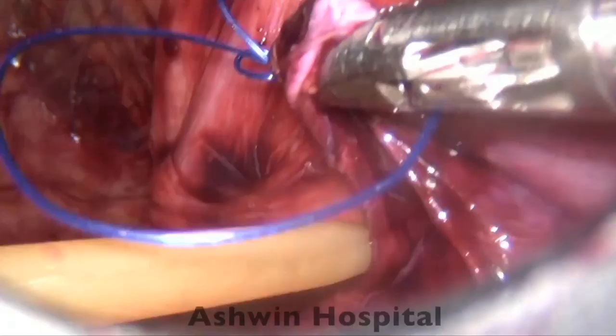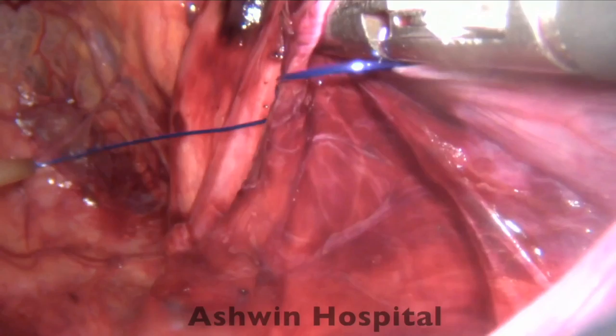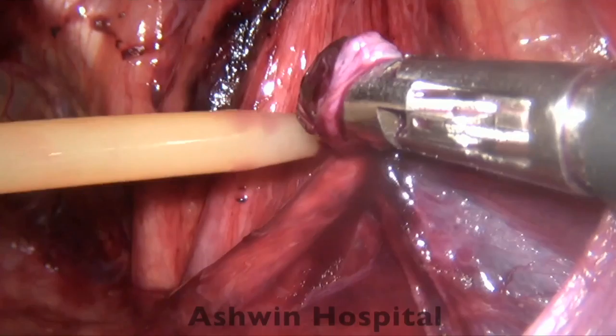So you have to always stick to the posterior rectus sheath and not go too anterior and buttonhole the rectus muscle. If there is a buttonhole in the peritoneum, you can apply an endo loop very easily, like how we are doing it right now, so that you don't lose the space too much. Or you can even do an intracorporeal suturing if you're using the lateral ports like how I showed you now.